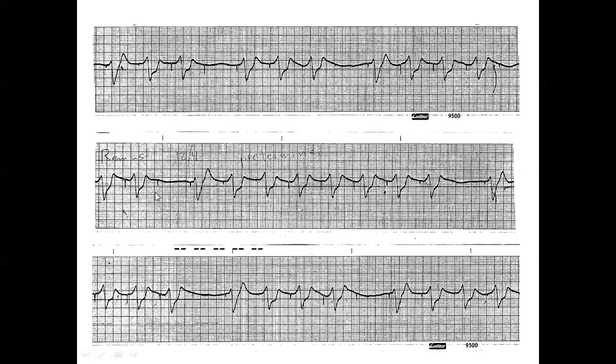I will claim that this is a Wenckebach phenomenon within the Purkinje fiber. So you have seen Wenckebach phenomenon in SA junction, AV junction, within the His, below the His, and within the right bundle branch, within the left bundle branch, and in the Purkinje fiber.